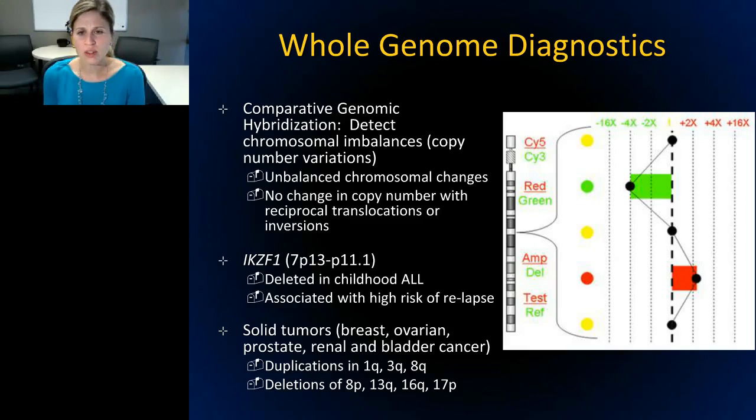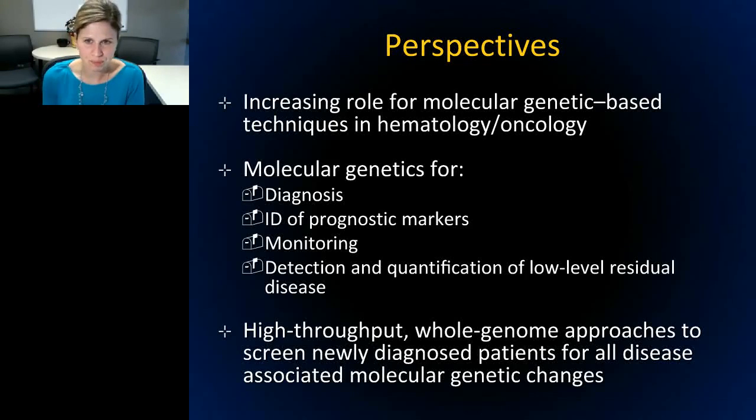What's observed over here on the right is that there are actually fluorescent markers that are going to be aligned with and attached to the chromosomes, and then there's going to be detection compared to what would normally be seen, and there will be an increase or a decrease in the fluorescence of these particular gene sequences, whether or not we have a duplication or a deletion. All of this leads to the diagnostic mechanism of cancer moving much more toward a molecular genetic-based mechanism of testing for these changes in the DNA, as opposed to using cytochemical stains or immunohistochemistry.